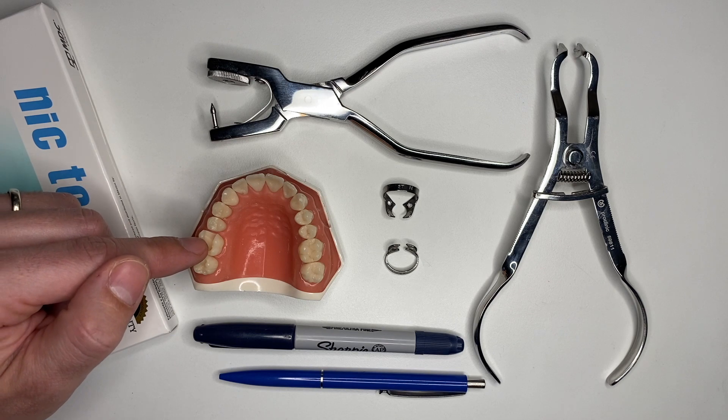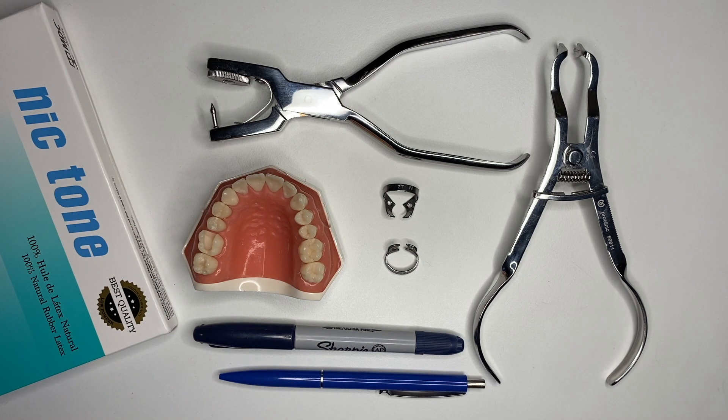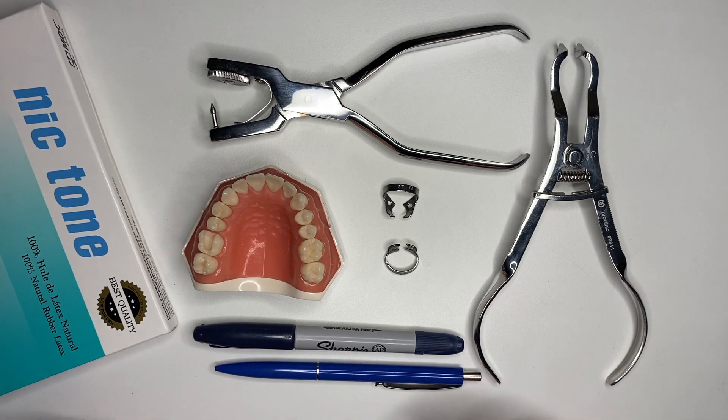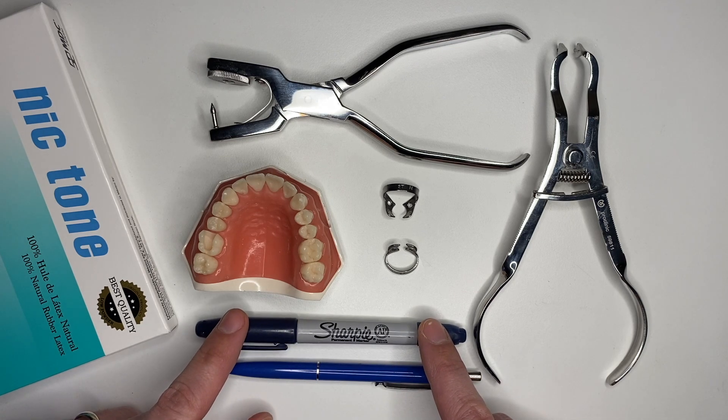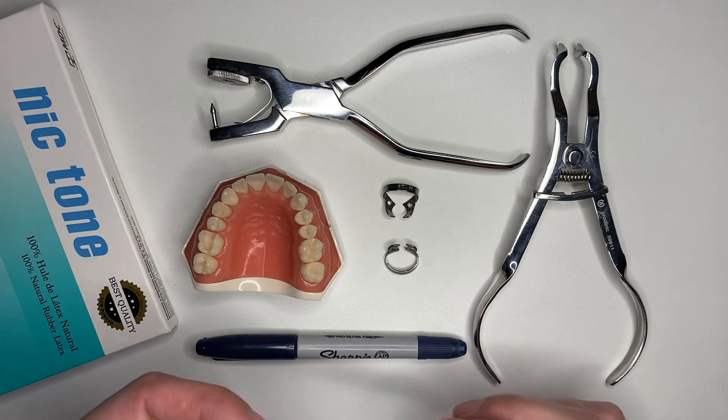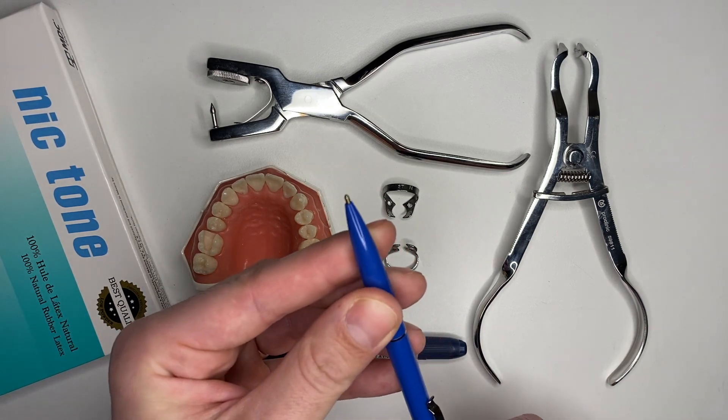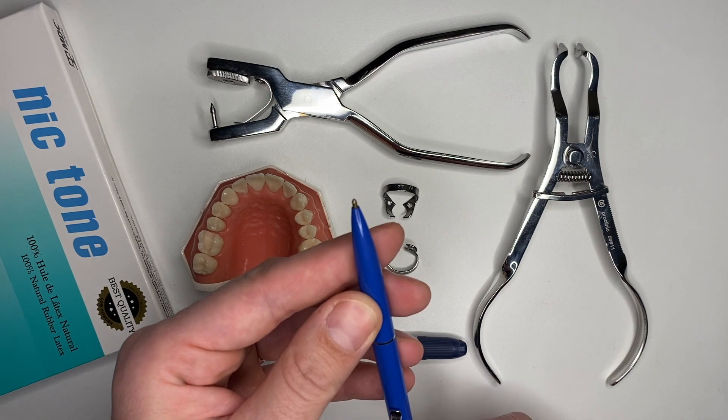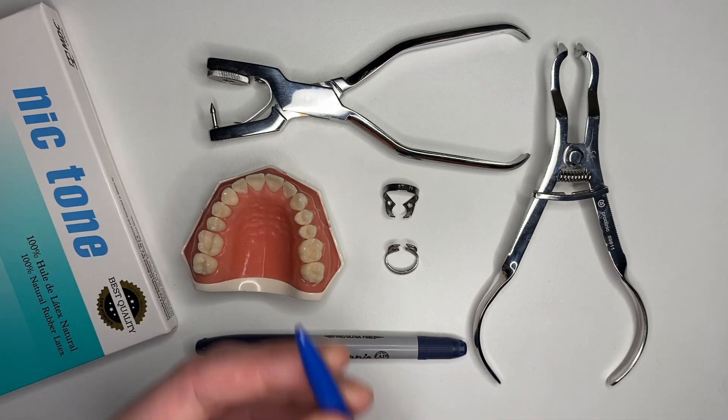First things first, make sure that you use a Sharpie or a marker to mark your rubber dam, because if you're going to use a regular ballpoint pen, this is going to damage the rubber dam and you might not be able to use it properly.